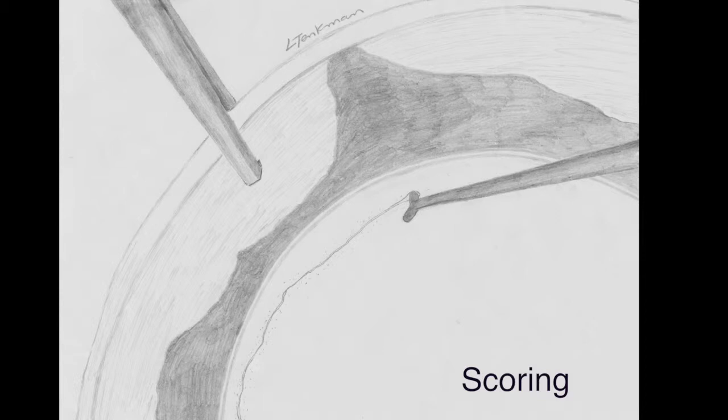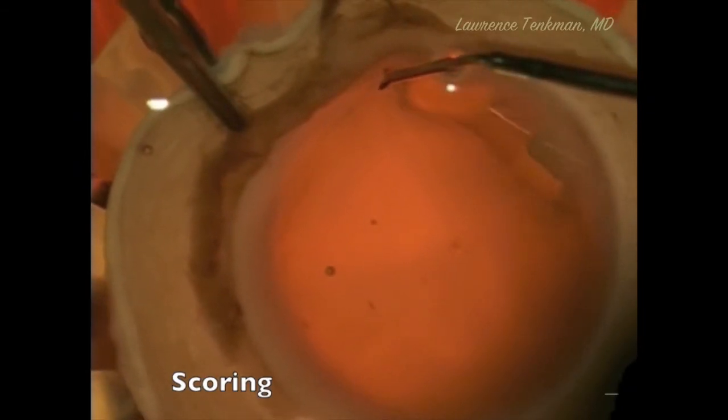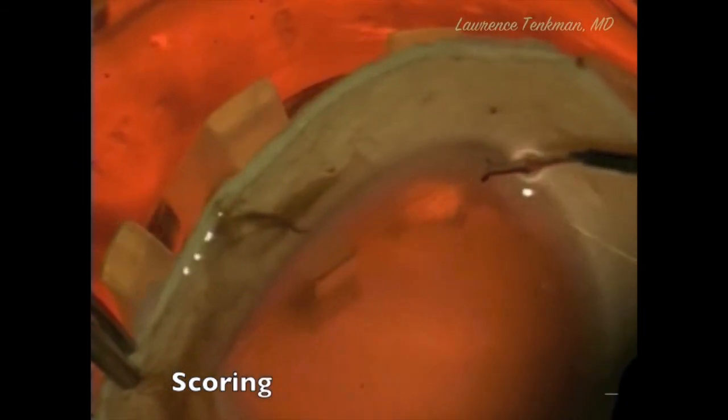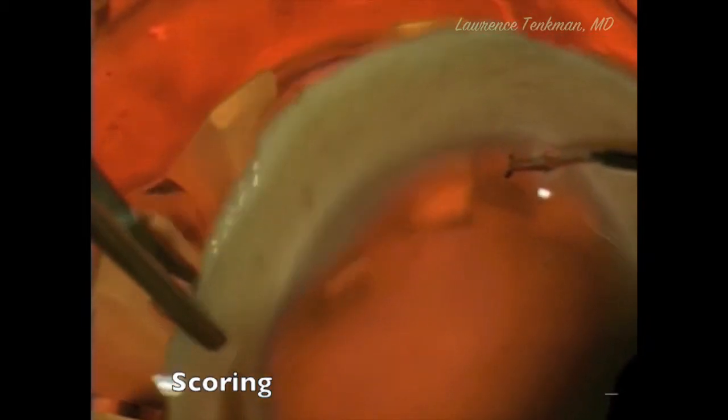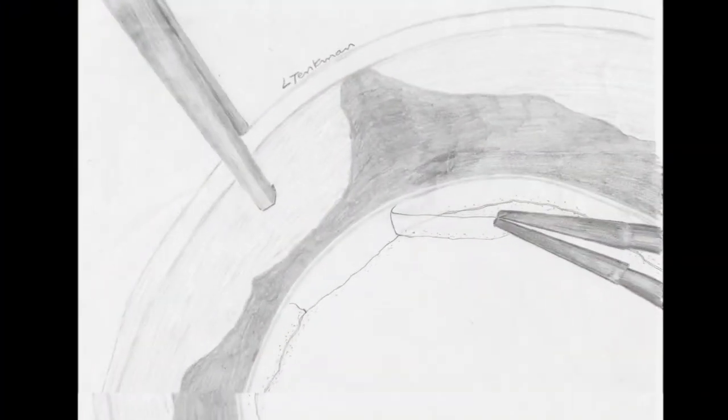Step 1 is scoring. We make a circumferential break in Descemet's Membrane, rotating the tissue or the basin to advance this break all the way around for 360 degrees. This break creates the edge that we peel later. We stain with TriPan blue so that we can see the break.